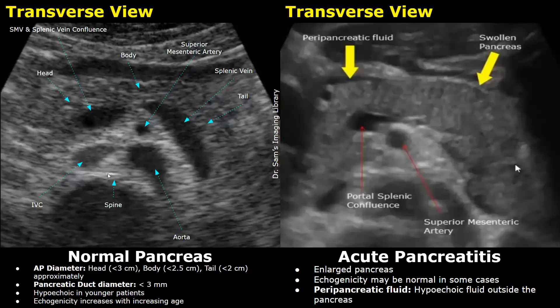Here is another case of acute pancreatitis. We can clearly see a swollen, enlarged pancreas. The echogenicity appears normal, but the gland appears enlarged and there is hypoechoic peripancreatic fluid.